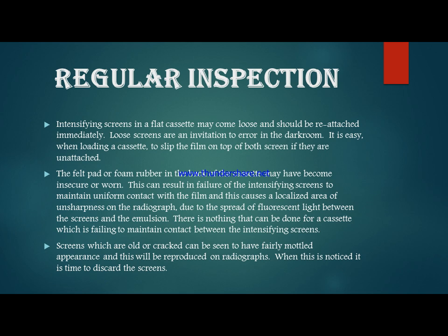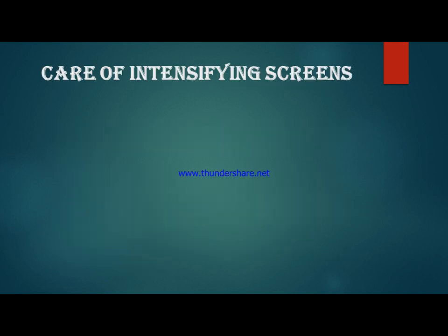It is easy when loading a cassette to slip the film on top of both screens if they are unattached. The felt pad or foam rubber at the back of the cassette may have become insecure or worn. Screens which are old or cracked can be seen to have a fairly mottled appearance, and this will be reproduced on a radiograph. When this is noticed, it is time to discard the screens.